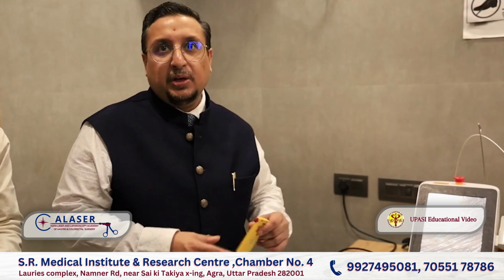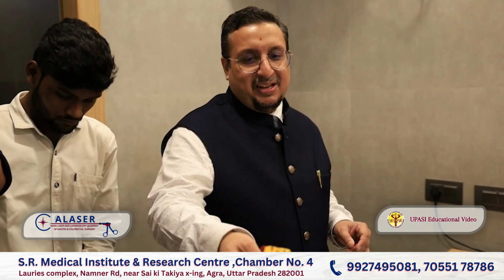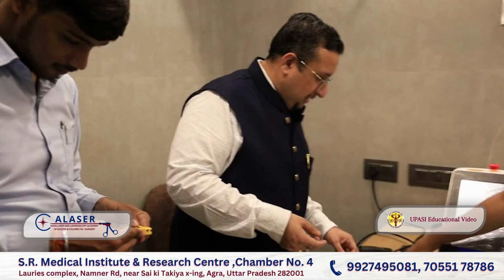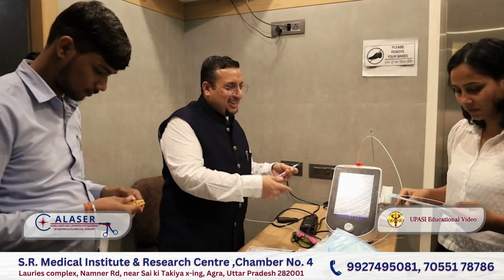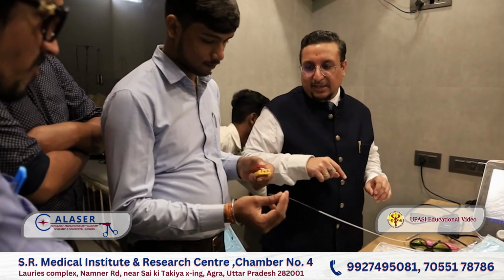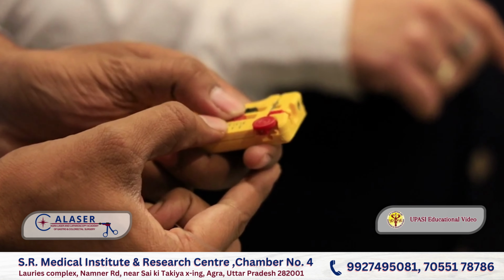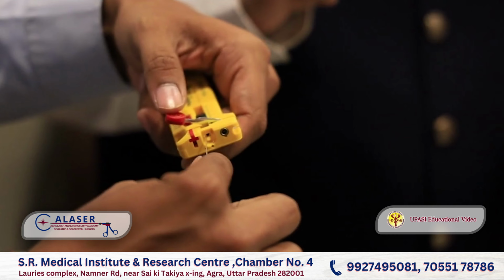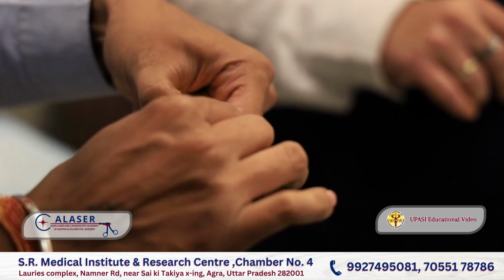This is the cutter. Raju, this is my laser man. कैसे काटते हैं फाइबर को बताओ. मतलब फाइबर काट के दिखा दो. कहाँ फाइबर? बेयर वाली कटर है. इसको कटवा दो. इसको बताओ कैसे, how to, ये बताएंगे कैसे करना है. You set it at 5 to 5.1 mm. Open this. We put this fiber, right? Down. We test from this.